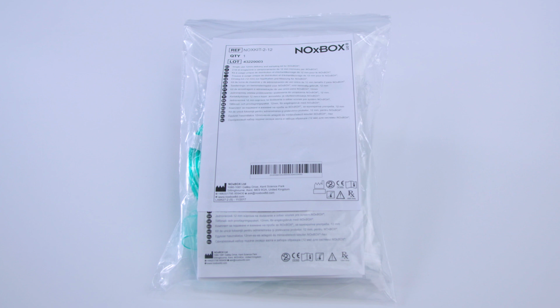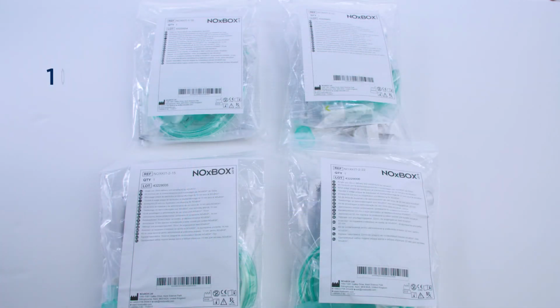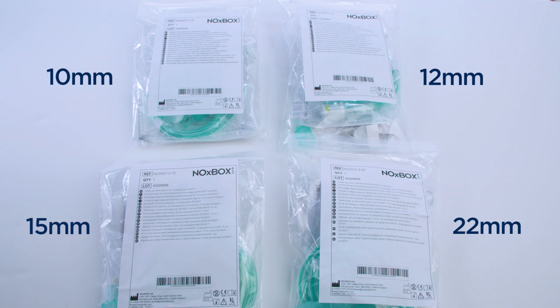Each procedure requires the use of a NOx kit, a single patient-use kit that must be discarded after each use. There are 4 sizes to choose from: 10, 12, 15, and 22 millimeter, depending on your ventilator patient circuit.